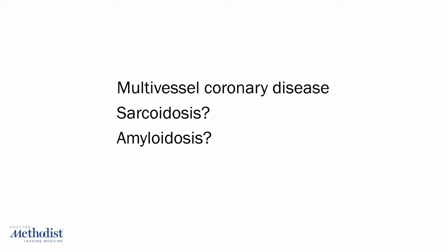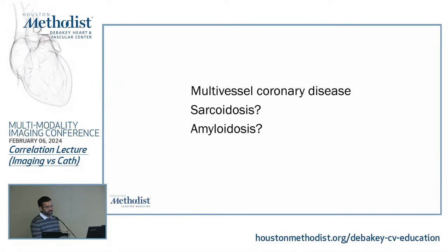So, what do you think? Multivessel disease, sarcoid, amyloid, and HCM. Hibernation doesn't explain the LGE that you saw. I think I looked at this chart before I came, and the guy was having a lot of arrhythmias. So the trigger of testing was kind of justified, I have to say, by the amount of non-sustained VTs. He had multiple shocks. He was upgraded. He was taken for ablations.